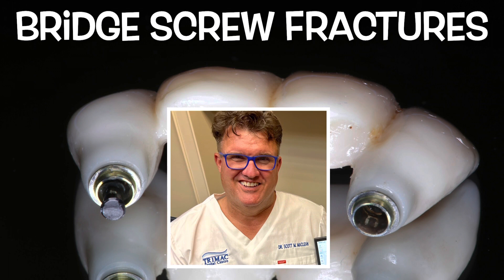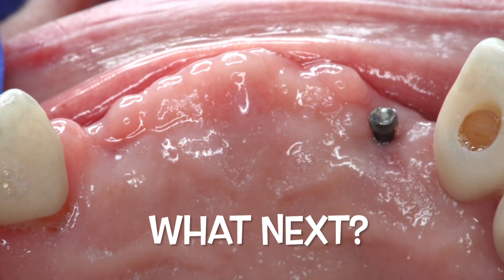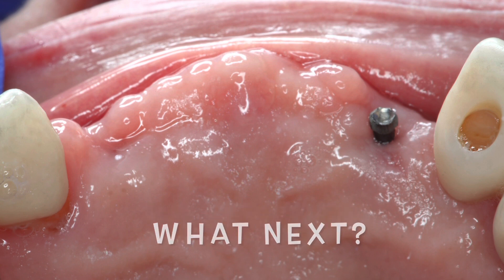Looking up close in the oral cavity, we can see that there is a screw sticking through the tissue — I like to see this. However, the other one has grown over, which is a bit more concerning because we know that the tip of the screw is likely up inside of the canal. So we're going to get both of these screws open.